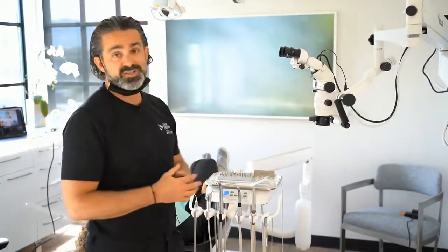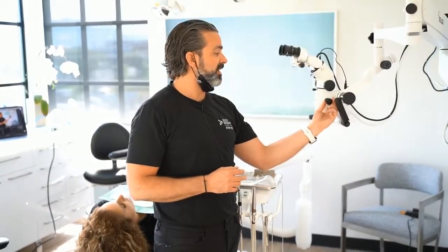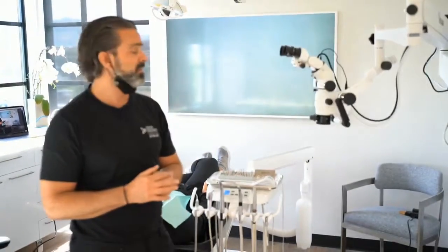A 1 step for me is a broad field of view. It's really more for something that you're seeing today. I don't ever really use the 1. 4 and 5 are really important in finding endoanatomy, so pulpal floor anatomy.